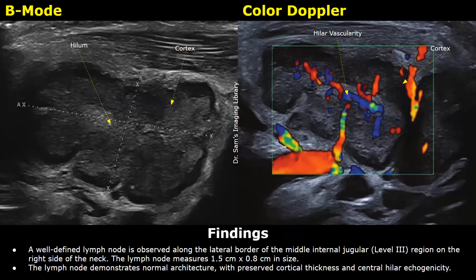These are the findings. A well-defined lymph node is observed along the lateral border of the middle internal jugular region — that is level 3 — on the right side of the neck. The lymph node measures 1.5 by 0.8 centimeters in size. The lymph node demonstrates normal architecture with preserved cortical thickness and central hilar echogenicity.